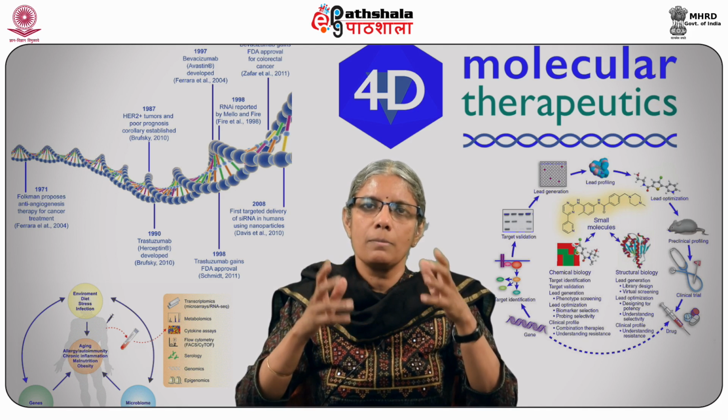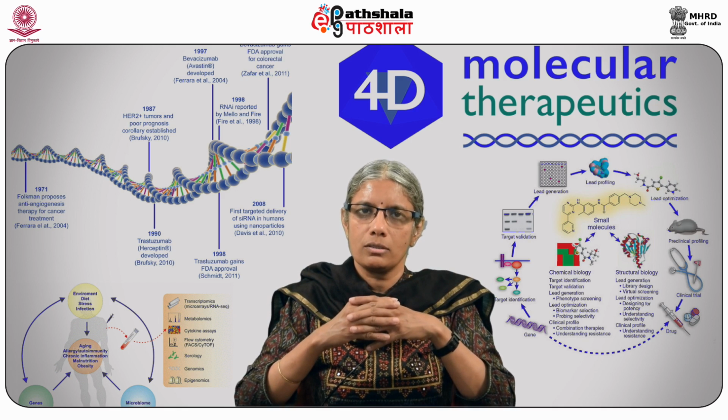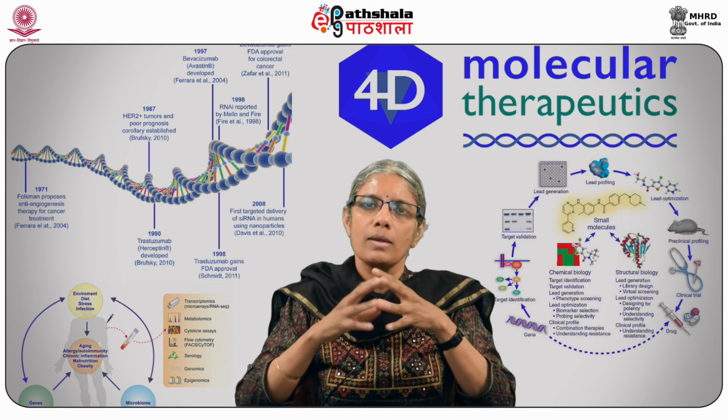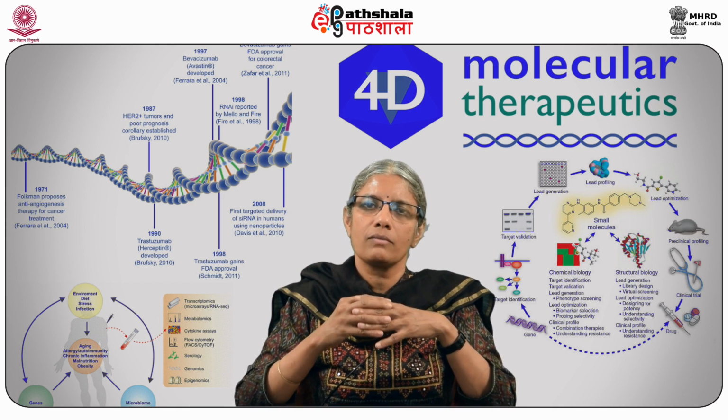The first permanent cell line was developed by Earle in 1943 from the subcutaneous mouse tissue, and in 1951 George Gey derived the first human transformed cell, which is famously called as the HeLa cell, and these are derived from a cervical carcinoma.